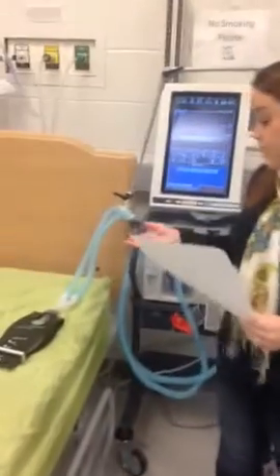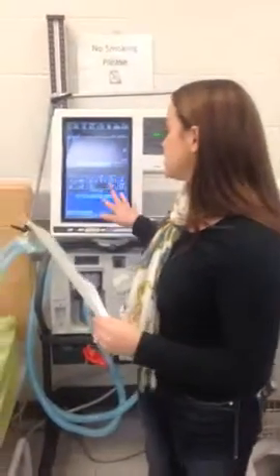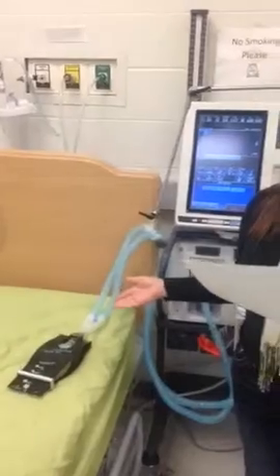Since there isn't a test lung that can breathe spontaneously, I'm just going to keep these settings. But just know that you would obviously put a patient on a spontaneous breathing trial to see how they would breathe on their own without any backup breathing.